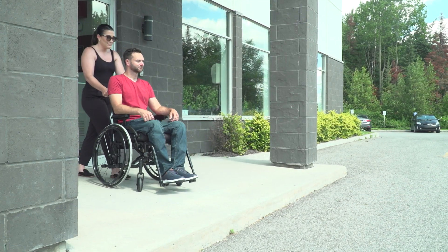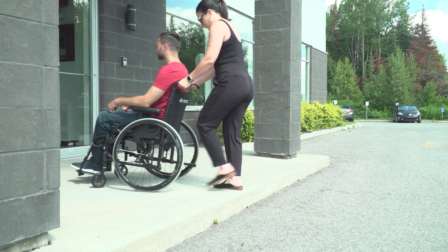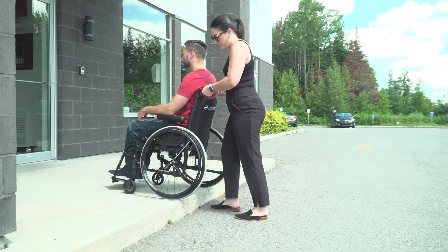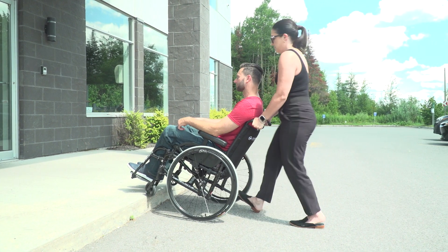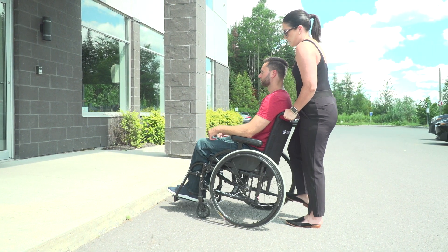To safely go down the curb, you're going to want to approach the curb backward, using your knee or your body weight to slowly lower the rear wheels, and then use the tip assist bar to slowly lower the casters onto the ground.